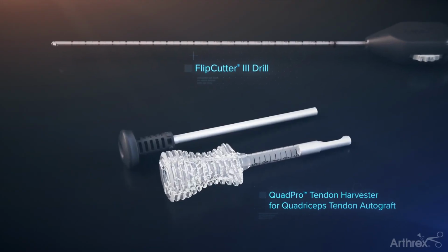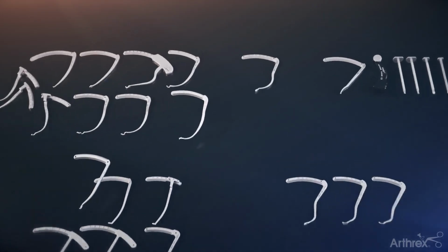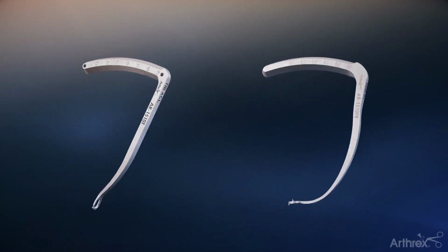The FlipCutter III drill provides flexibility to drill sockets 6 mm and 7 mm to 12 mm in half-size increments, all through a 3.5 mm hole with a single device. A comprehensive portfolio of ACL and PCL marking hook guides, as well as additional instrumentation for the surgeon to perform the procedure, are available. For this particular procedure, we'll be using the tibial ACL reconstruction drill guide and the footprint femoral ACL guide.